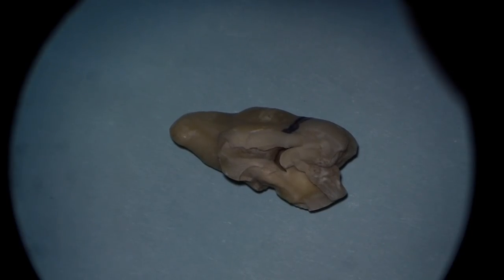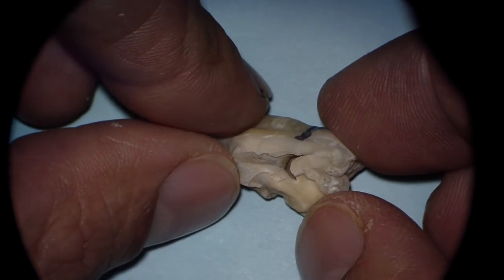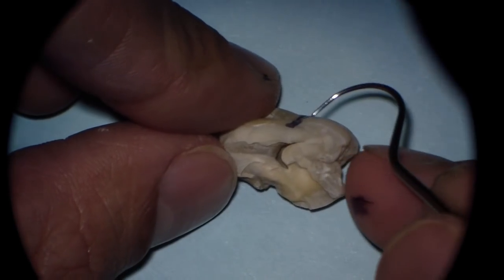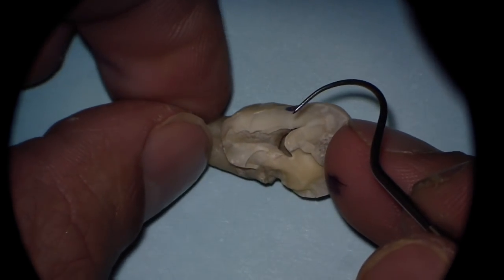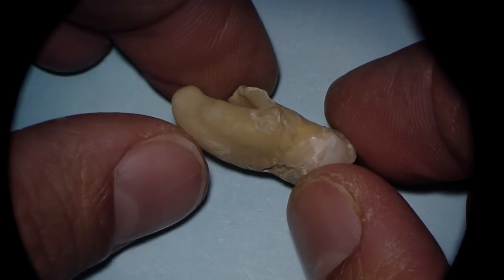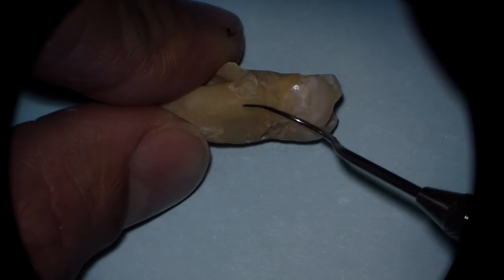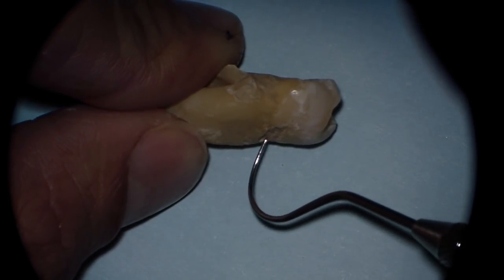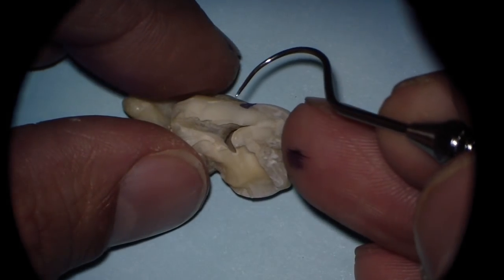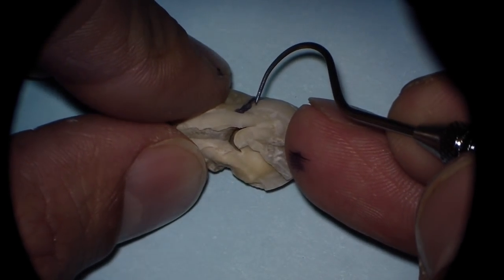Let's take a look here through the stereomicroscope. I was in the oral surgery clinic and found some extracted teeth. This one was fractured, so it worked out perfectly for today.